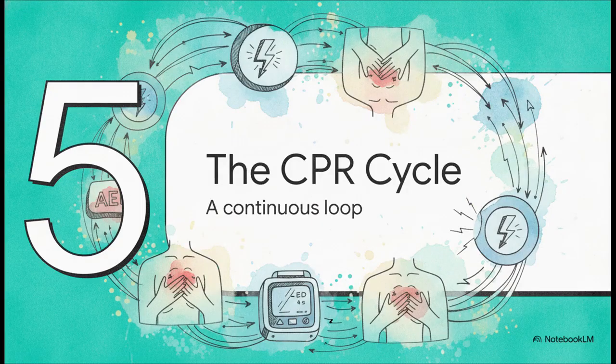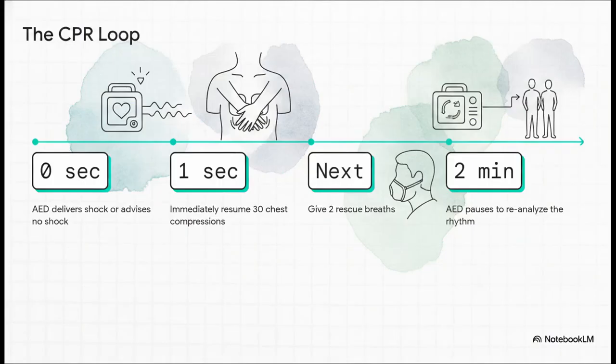Which brings us to Section 5, the AED and CPR cycle. It's a continuous loop. You see, an AED does not replace CPR. Rather, the two interventions work perfectly together in a continuous life-saving loop that maintains blood pressure and oxygenation. Coordination here is just everything.